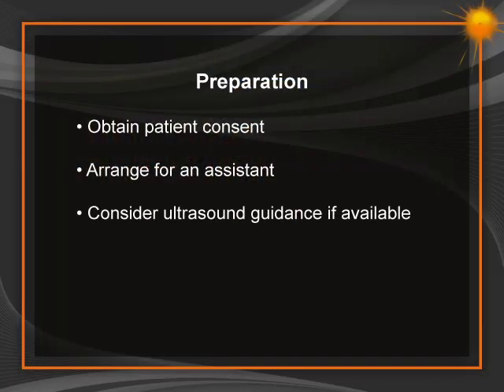Consider ultrasound guidance if available. Not only will it detect loculations or other challenges to a straightforward thoracentesis, but you can use it to mark the site for best access to the effusion for maximum drainage.